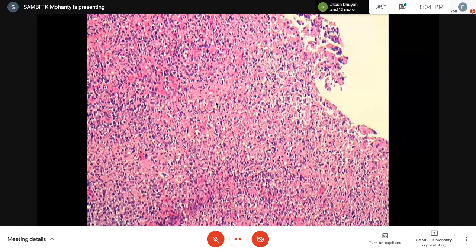And here we have an infiltrate. What is more important to the infiltrate is these eosinophilic areas in between. I give a lot of importance to this area because of ulceration. There is some fibrin and granulation tissue formation. But in addition, big cells are kind of hiding within this infiltrate because it's composed of neutrophils as well, and we have this vascular problem.